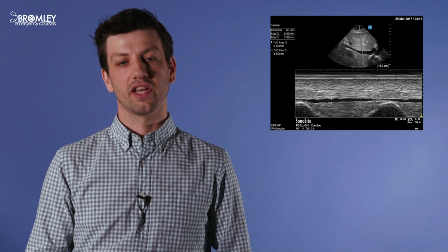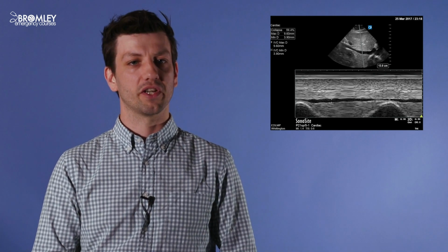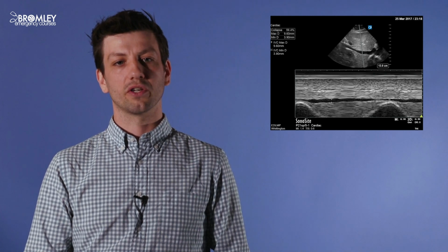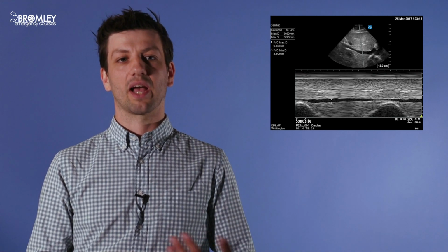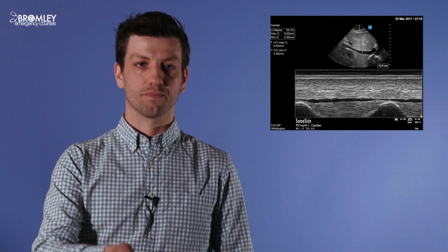Here we see an M-mode image taken through the IVC. So we see the IVC over time now in that bottom part of the image, and this allows us to measure that collapsibility index. As you can see, we've taken 2 diameter measurements, one during inspiration and one during expiration, and we measured that collapsibility index, and the collapsibility in this patient was more than 50%, so what we would expect in normal patients.